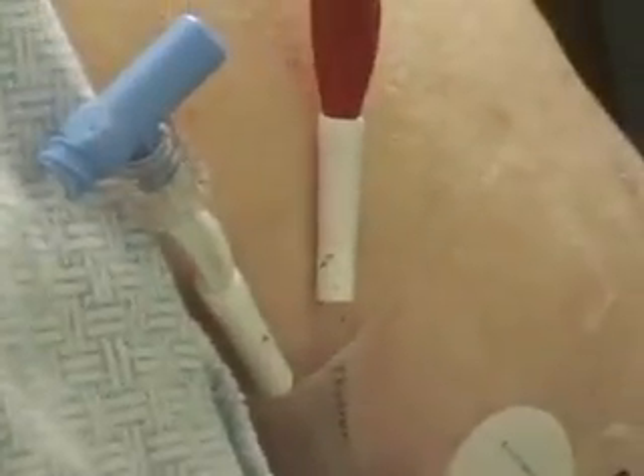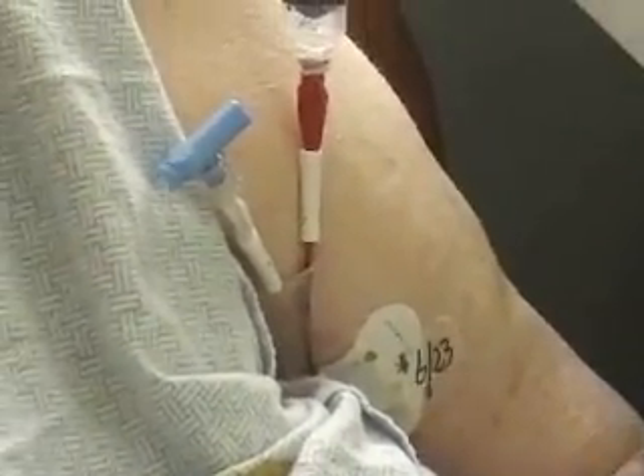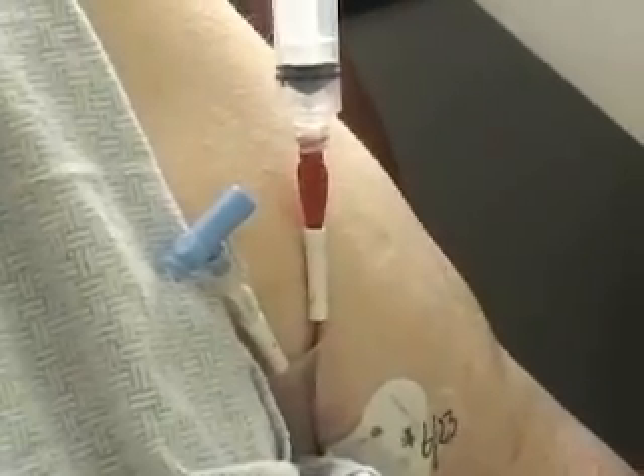Which port? Why did you decide to use that port? You can use either port, but generally I just picked the red port for blood. We haven't drawn from hers before, so I don't know if it's even going to give me blood.